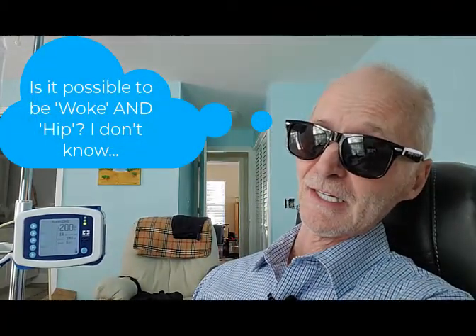Hey, how you doing? I'm the local hipster about the pump. Now the pump is the best, and I don't know what that idiot is thinking about when he's talking about gravity. The pump is the best because it takes care of everything for you. You don't have to worry about the drip rate, or about having to unplug at a certain time and plug back in. The pump takes care of it for you. So man, stay woke, stay hip, and I am going to take care of that guy. He's an idiot.